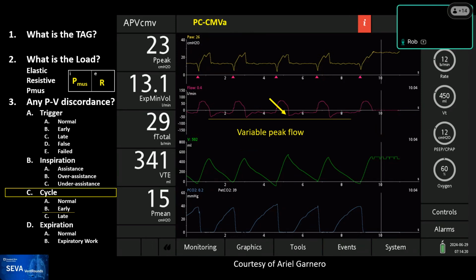Yeah, and the other thing, just instituting an inspiratory hold can cause the patient to relax. What did Megan say? It popped up and it was so long I couldn't read it. There was a comment by Megan. Could you tell me what it was, Ari? Yes, she said that she can see early cycling now that she's looking for the waveform. Do you think it's causing the asymmetric deflection of the pressure waveform that was here? Up here? Yes.